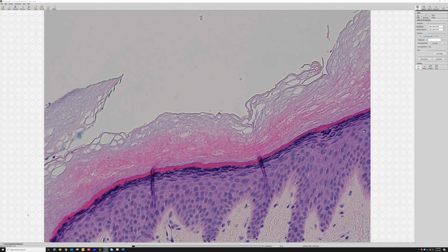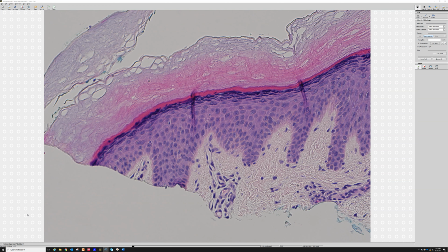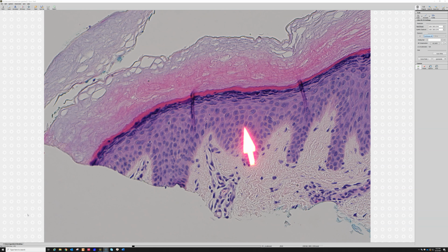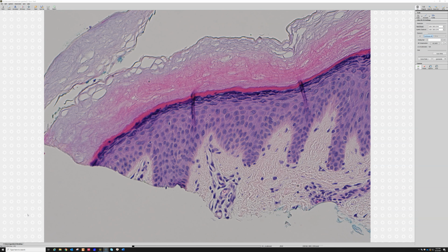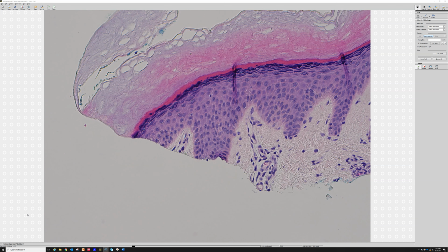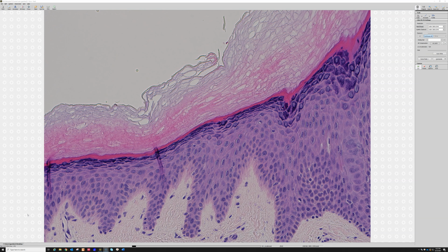And it's a layer that we were always taught in med school, you know, the basale, spinosum, granulosum, lucidum, corneum. But the only place you actually see the stratum lucidum in the body is acral skin, that is palm or sole skin, or skin that's been rubbed and scratched chronically. That's called lichen simplex chronicus, a reactive thickening of the skin from chronic irritation, okay?